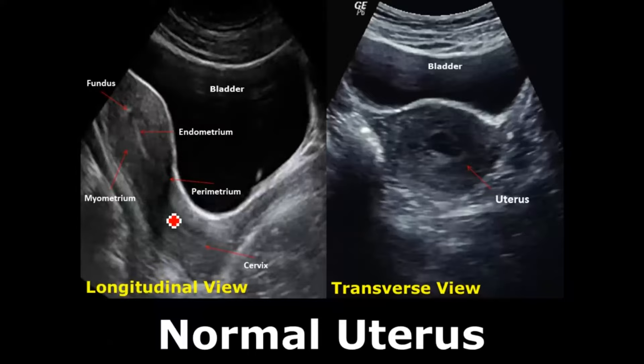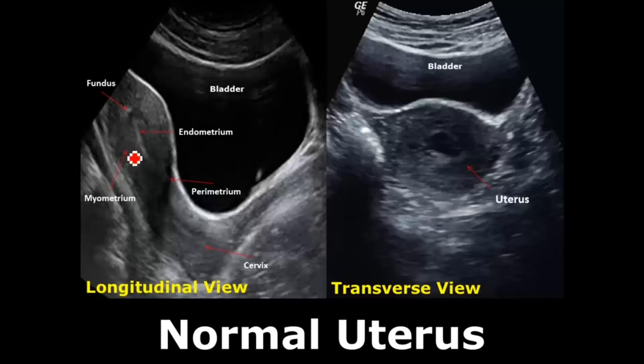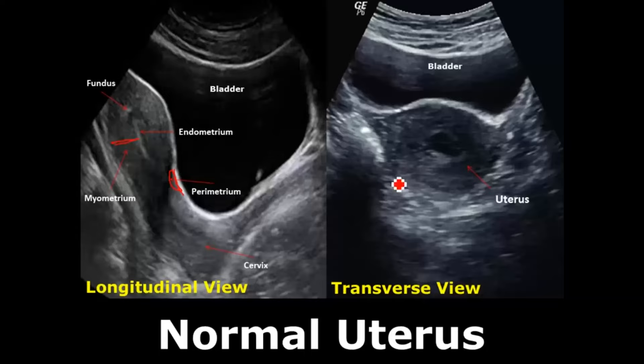In the longitudinal view, we see the most detail. The three layers of the uterus: the endometrium is the innermost layer, the myometrium is the thick muscular middle layer, and the perimetrium is the outermost layer. The top portion is called the fundus, and the lower end where it meets the vagina is the cervix.